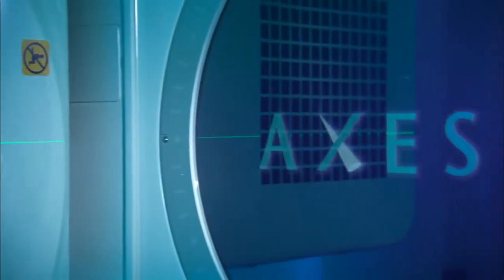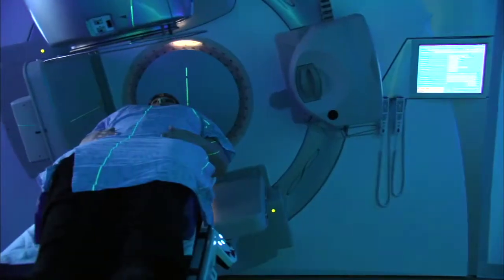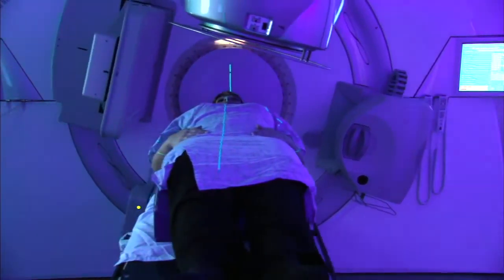Once preparation is complete, treatment begins. The new Elekta equipment is extremely accurate. You're diminishing a lot of the side effects that we had years ago because you don't have to blast a lot of the area that might be right next to the tumor that you're treating.